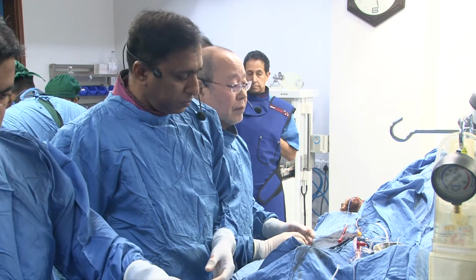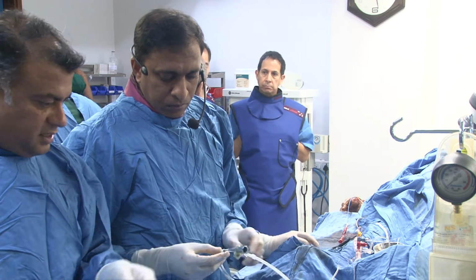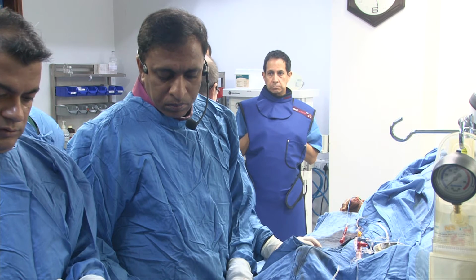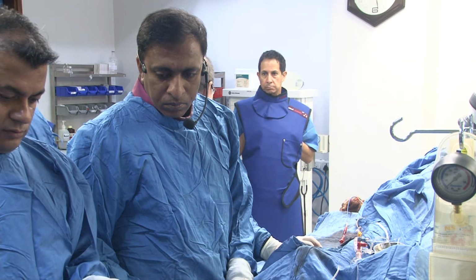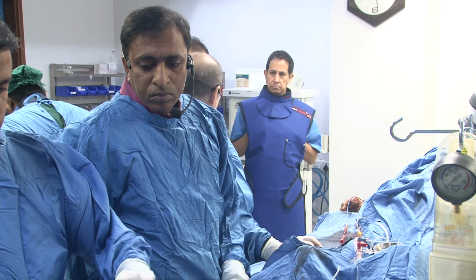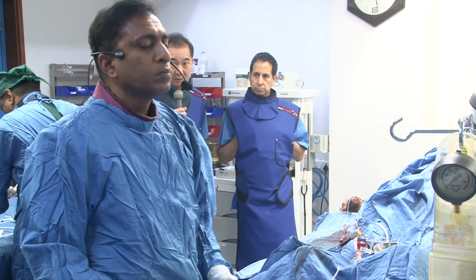So if you see a lot of calcium, would you do atherectomy? Even though maybe your wire is subintimal? Yes, in this case I will take a Rotablator. Even though your wire goes into subintimal, you think it's okay, right? Yes, no problem. 125 or 15? No, at least 175. Start with 175. No problem for subintimal. Maybe only 1.75 I take, and after that I will place a stent. Otherwise, we cannot achieve enough expansion of the stent.